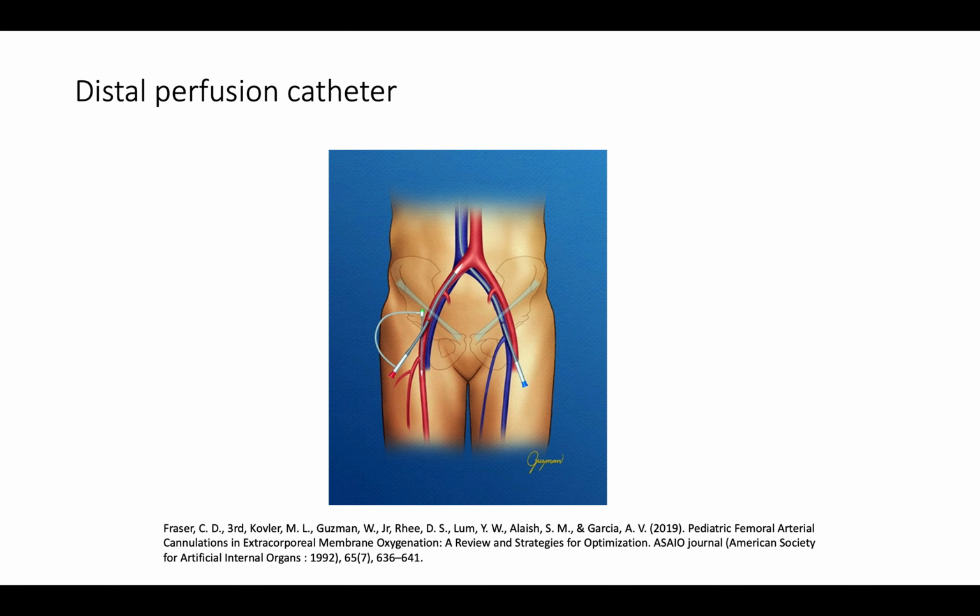It is important to recognize that the femoral artery is an end artery, therefore femoral cannulation can lead to limb ischemia. Also, the venous cannula can obstruct the venous return, which could aggravate this ischemia. Occasionally, even obstruction to venous flow can lead to limb ischemia in its own right.